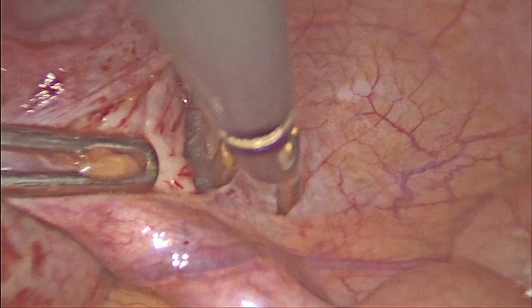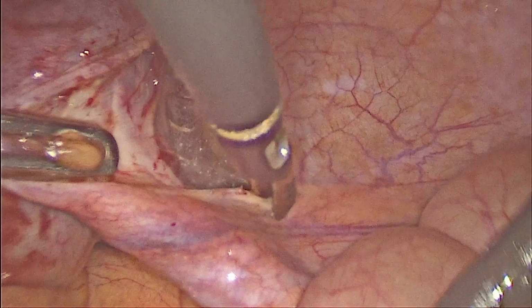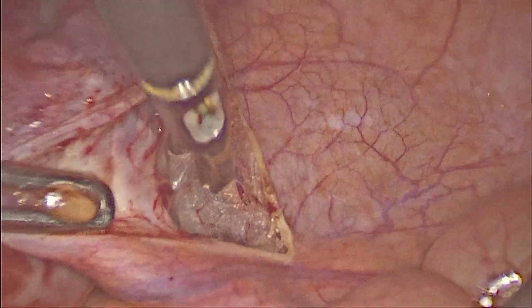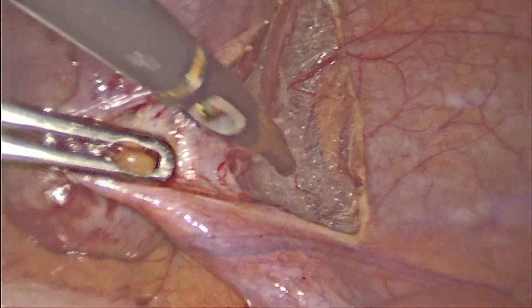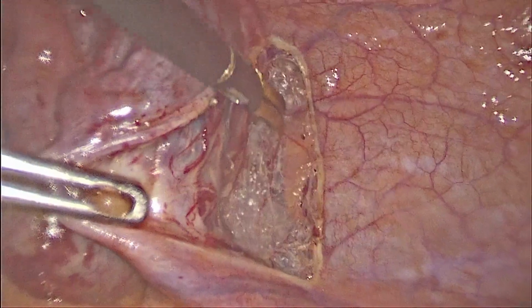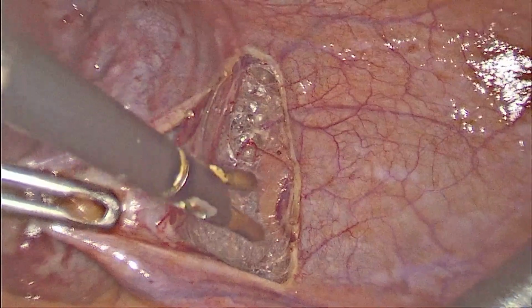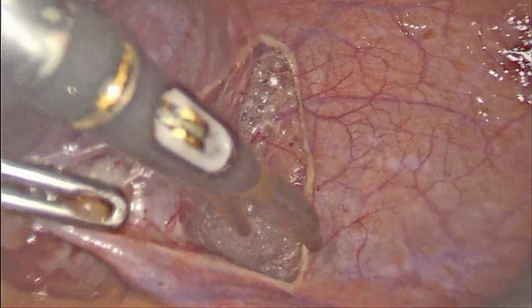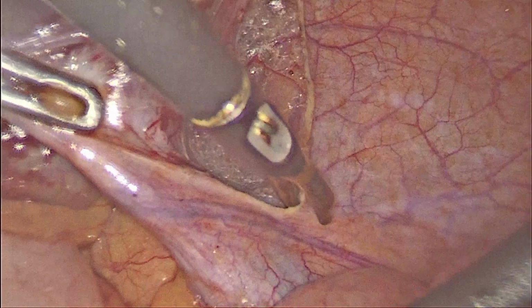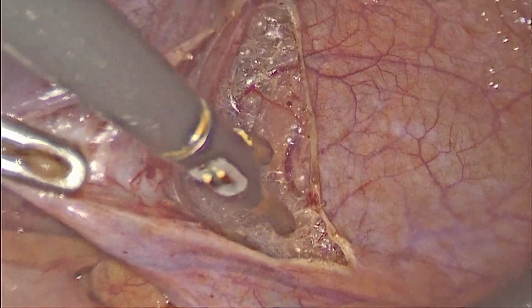There was a right tubo-ovarian mass which was stuck to the posterior surface of the uterus and the rectum on the right side. So we started the surgery by opening the peritoneum between the round ligament and infundibulopelvic ligament so that we can identify the ureter, and then we can divide the infundibulopelvic ligament on the right side.